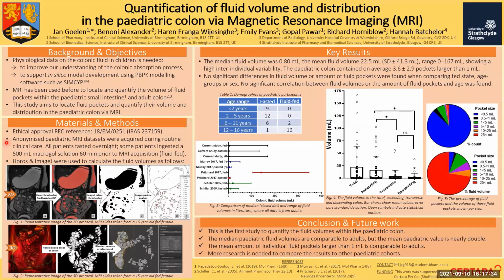So this would give us a fluid-fed population, which is not fully representative of a high-calorie meal, to be precise. Then to extract fluid data from those MRI datasets, we use 2 different protocols, a 2D protocol and a 3D protocol. In this 2D protocol, as you can see here, this MRI dataset is just black and gray. So first we have to identify all the free fluid zones, which you do by thresholding against the cerebrospinal fluid, because the cerebrospinal fluid is free-flowing fluid.